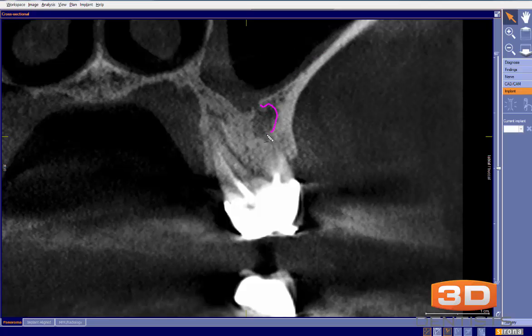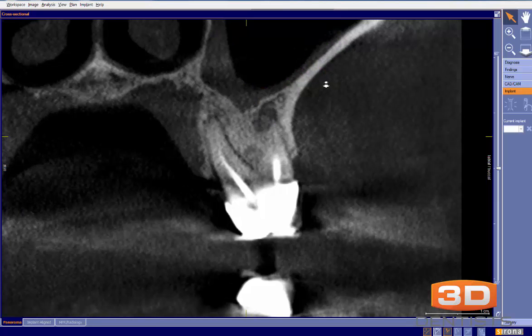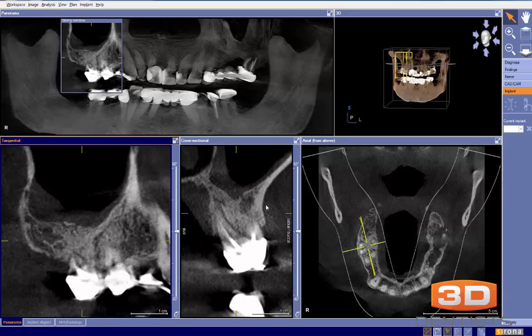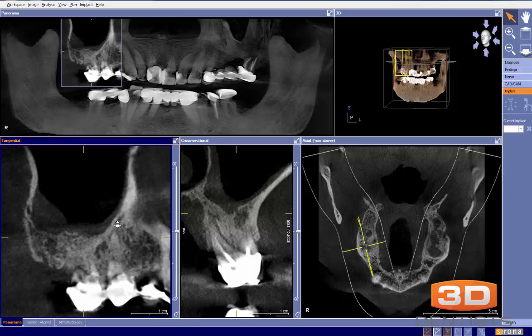Right here is our break, and we can see that there's a potential that much of this area could be caused by this tooth. So this leads me to an ICD or medical diagnosis code of periapical with sinus involvement, because it is going into the sinus. This would lead me to consider doing some type of treatment for this tooth.